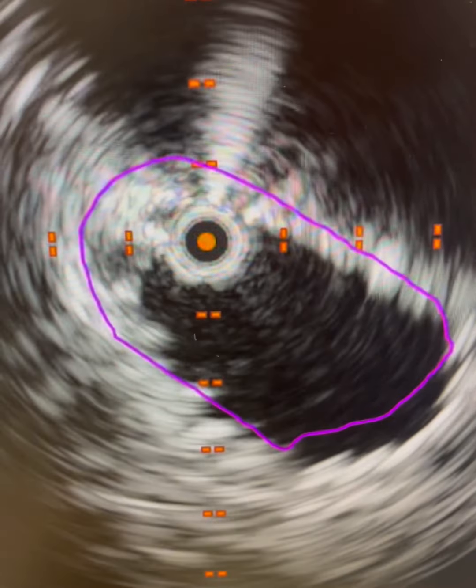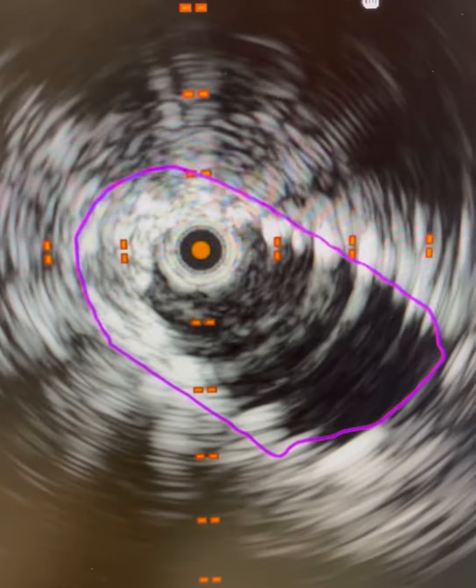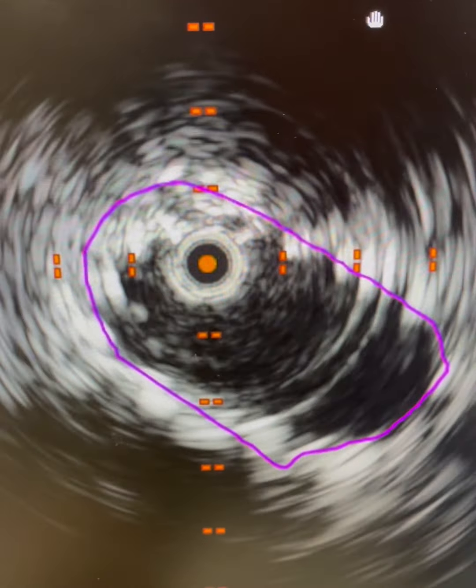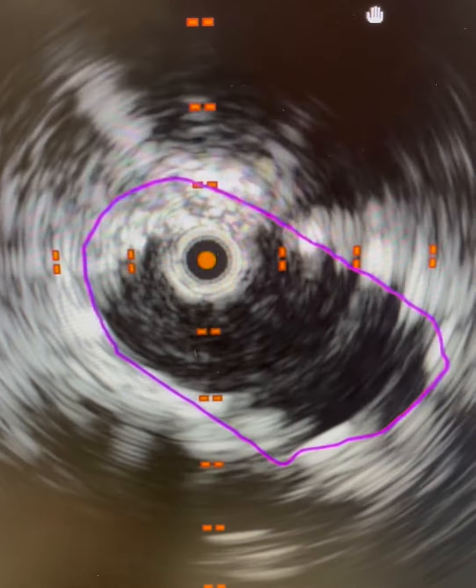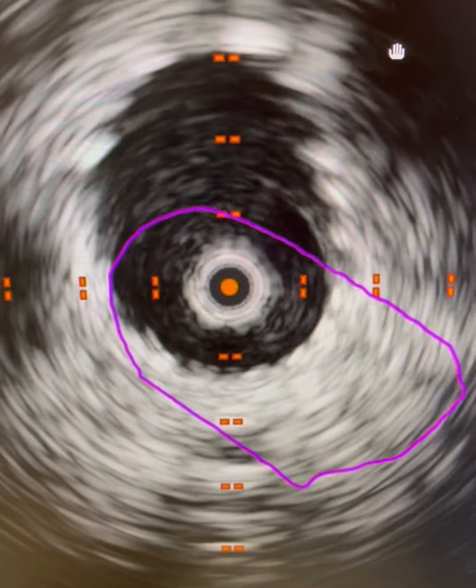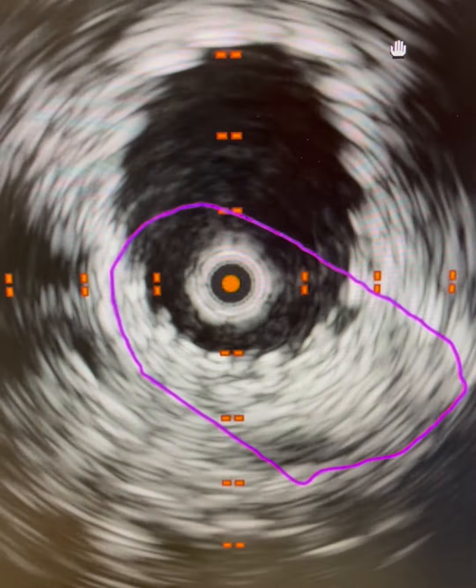And this is the intravascular ultrasound catheter being pulled back from the inferior vena cava through the stent after post-dilation with the 18 millimeter balloon. With the new venous dedicated stents, we do not feel obligated like we used to back in the days of the wall stent of laying the stent across the contralateral wall of the inferior vena cava. As you see here, it barely touches that.